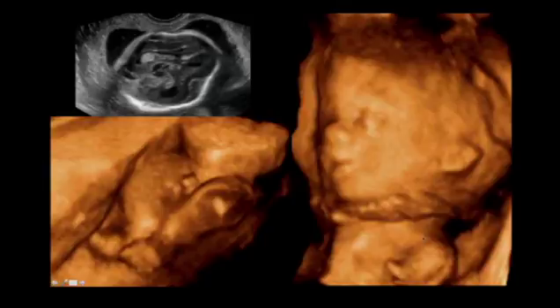And yet again, another fetus with the same syndrome, thanatophoric dysplasia, showing that S-shape appearance of the lower extremity, which is so typical. This one has more of a cloverleaf shaped skull, which we see in thanatophoric dysplasia type 2.